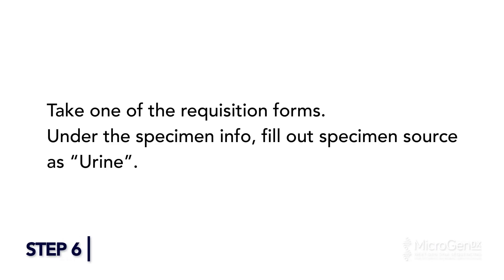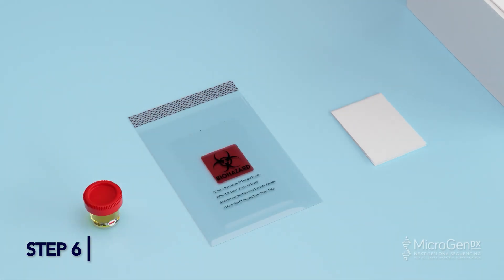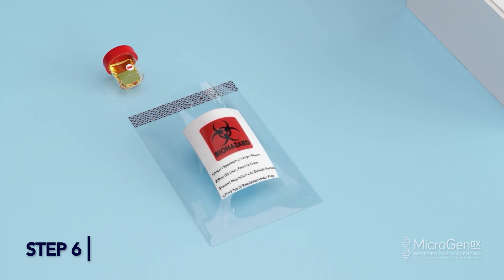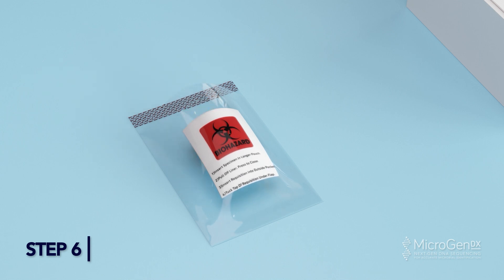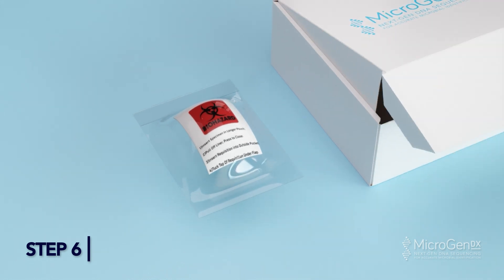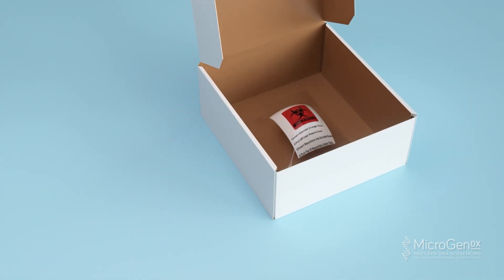Step 6: Take one of the requisition forms and under specimen info, fill out specimen source as urine. Place your completed MicroGenDX lab requisition form in the front pocket of the bio bag. Place the 90ml collection cup inside the larger pocket of the bio bag. Peel off the adhesive strip and press to seal the bag. Make sure to place the lab requisition into the same bag as the urine sample. Place the sealed bag into the MicroGenDX box, but do not close the box until both samples have been taken. Proceed to take the semen sample.